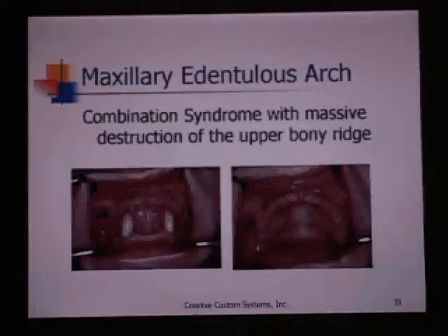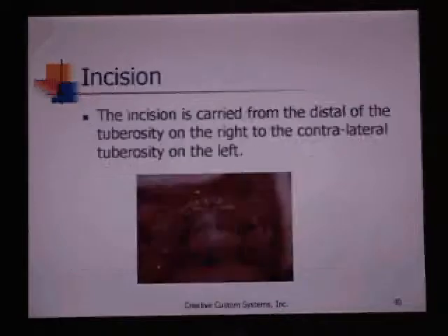Combination syndrome with massive destruction of upper bony ridge. This patient, when you palpate the upper maxillary ridge, is very knife edge, very thin. No way that you can get root form implants into this patient.